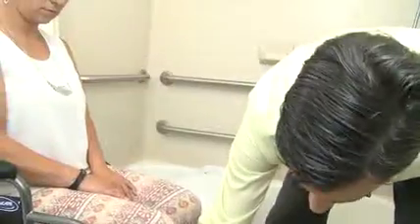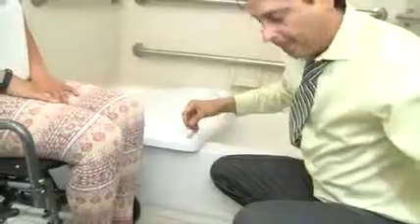If the person being assisted is unable to stand, position the wheelchair parallel to the tub and next to the bathing board. The wheelchair seat and the bathing board should be as close to each other as possible. Lock the wheelchair brakes and swivel the front wheels out of the way to a rear-facing position. Remove the armrest closest to the tub.